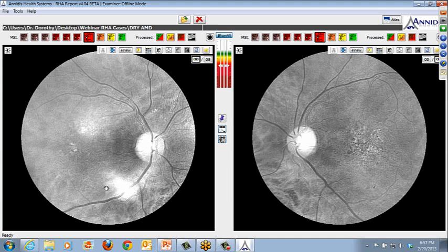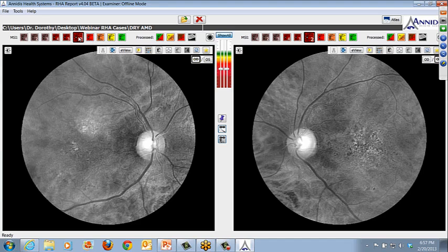So, and again, you're going to see some technical issues in some of these, and I actually left these in here on purpose because on this particular image, the technician probably should have retaken this particular slice, okay? But nonetheless, you still have a number of other RPE views. Starting in the most anterior portion of the RPE, you can definitely see migration of the melanin pigment.